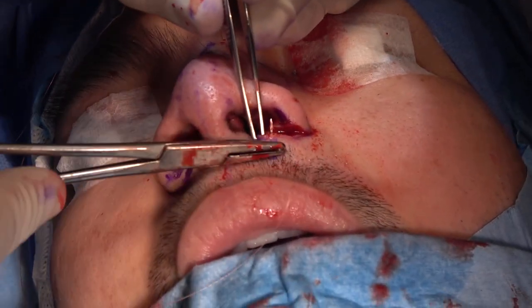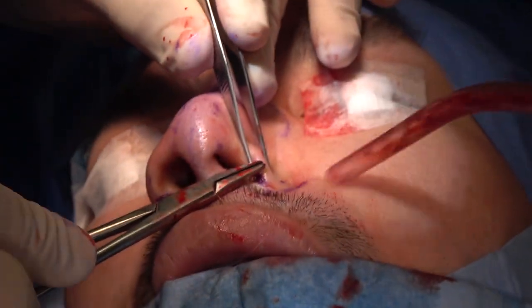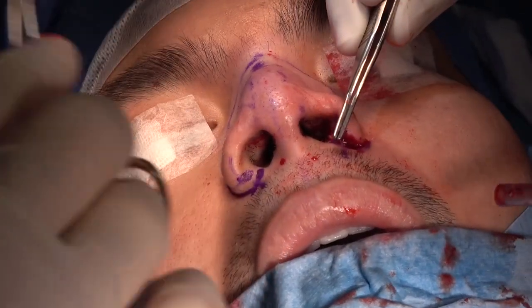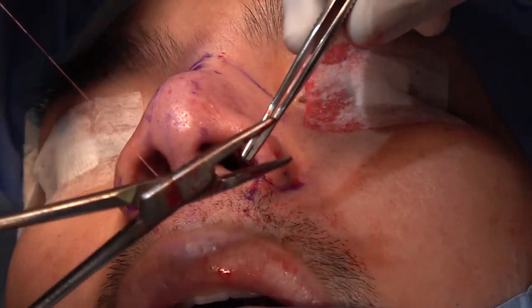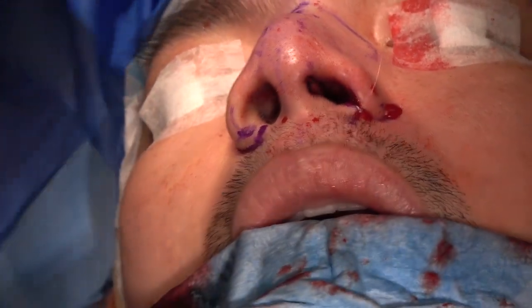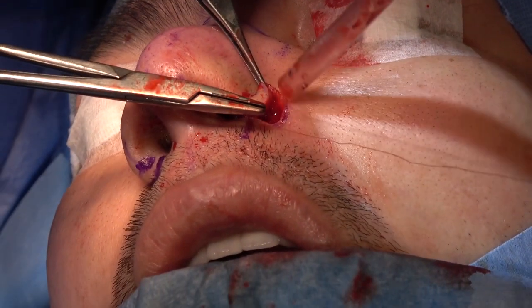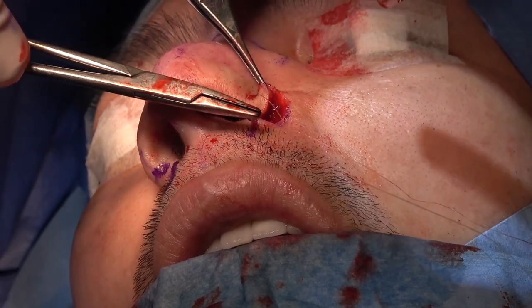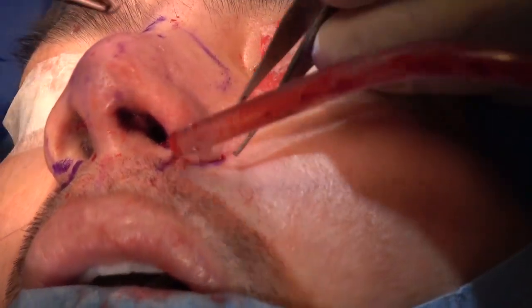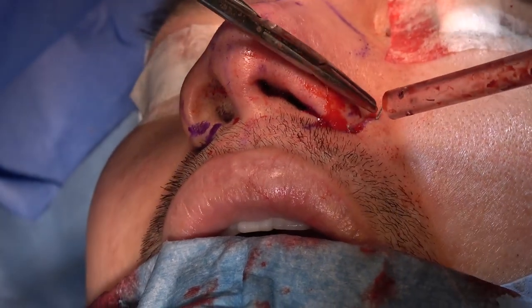Start the first suture, where we marked the first suture. You see, now we achieved a nice straight edge to edge because we marked the first suture. Nice straight edge to edge. Go now. Subcuticular. Stay in subcuticular.